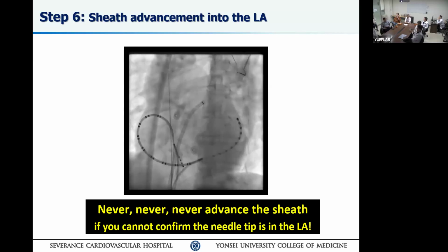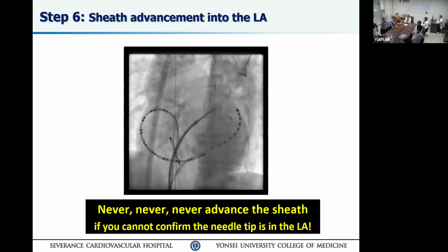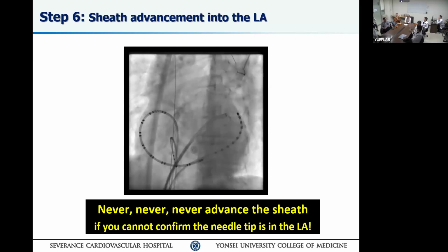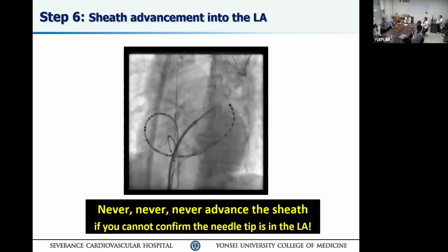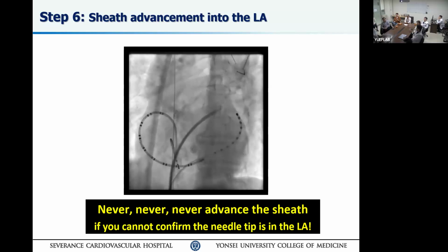to do it under X-ray. That's why I have many fellows from the US come to third world countries, and they don't know how to do transeptal, taking them over to the left-sided pathway. This is a serious problem. So that's what I'm telling you. I'm glad you guys did the transeptal well and did all the steps, so it is a very good thing.